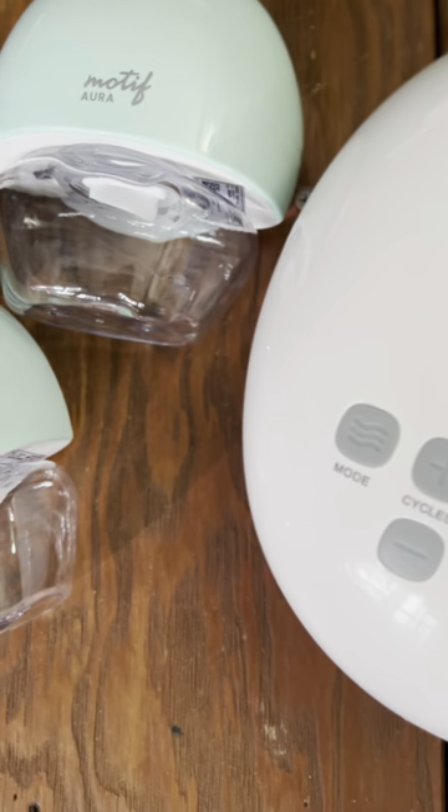Everyone is different and some say a wearable pump is just as good as using an electric pump. You may find that both are great to have around — more tools in your toolbox. And pair that with a nursing bra that can help support and keep your pumping parts in place. You can learn more at motifmedical.com/blog.